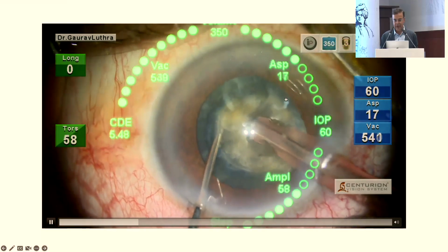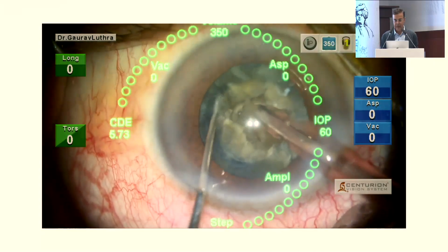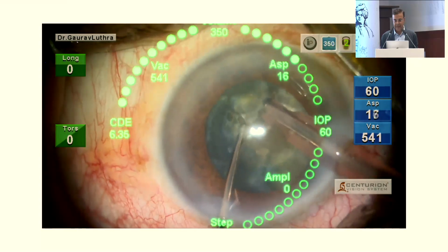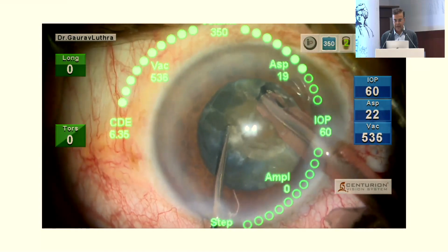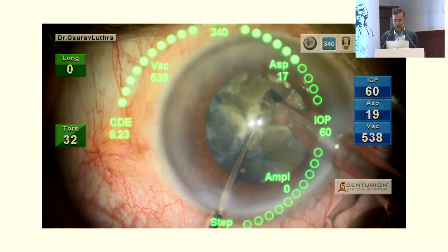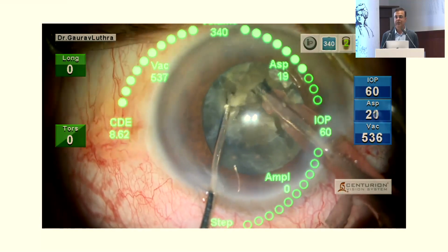So just keep watching. Just watch that area. As I do lateral separation, my rhexis will just give way somewhere here. And with this lateral separation, it just goes out. So these are weak points. What I'm trying to convey is that sometimes your rhexis will have weak points.